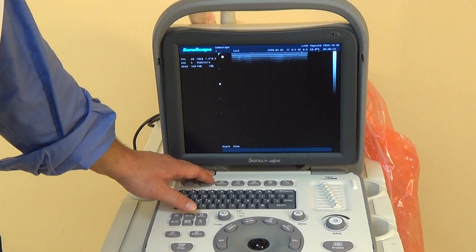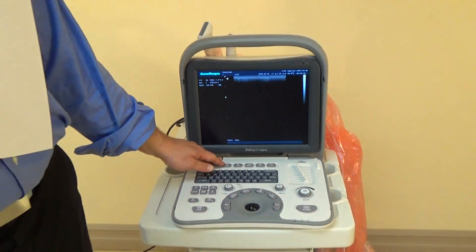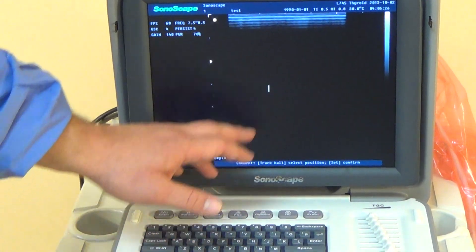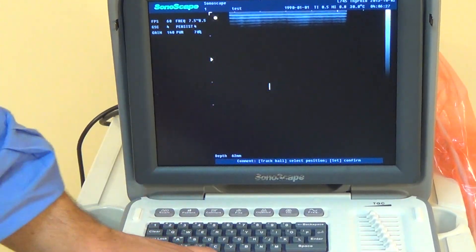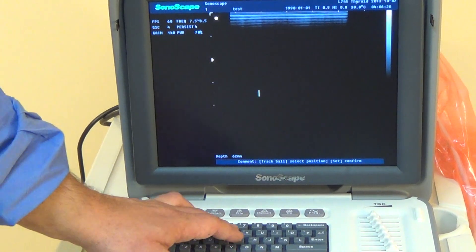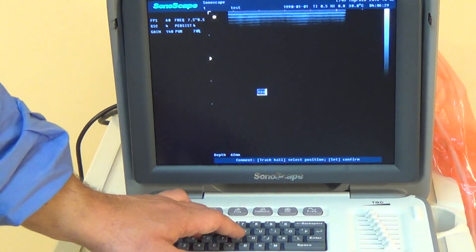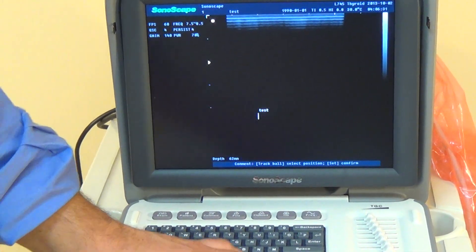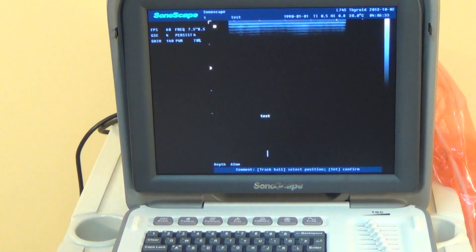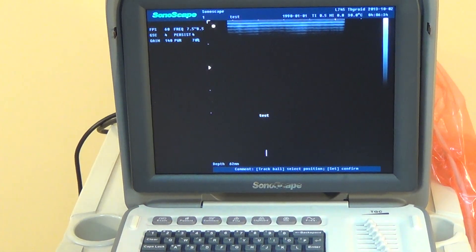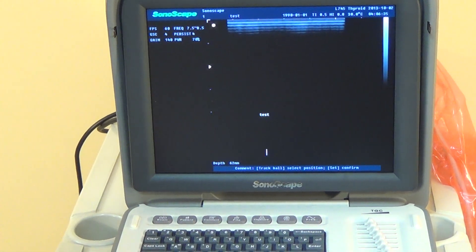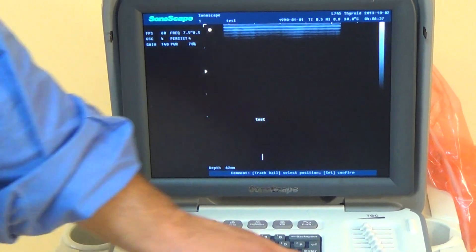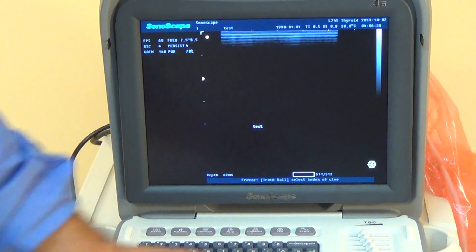The next very popular button is the comment button. When you press it, you get a cursor. You then go ahead and set that cursor where you like, and that's where it'll stay until you unfreeze it for the next image. That's a button that pretty much everybody uses pretty often.